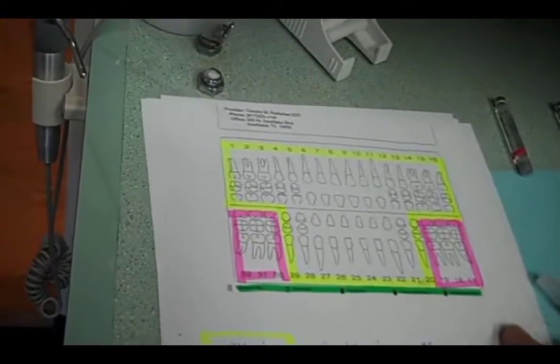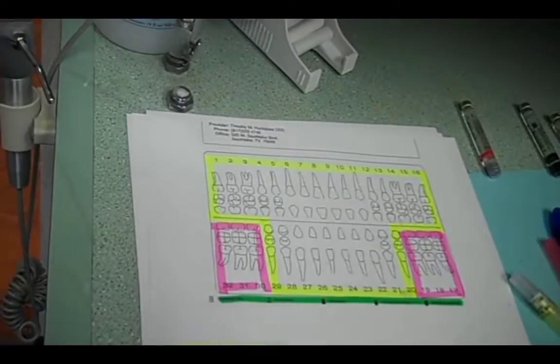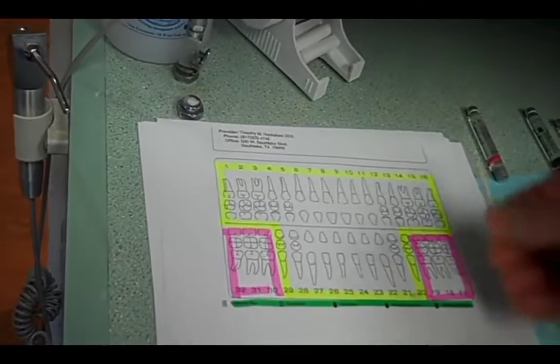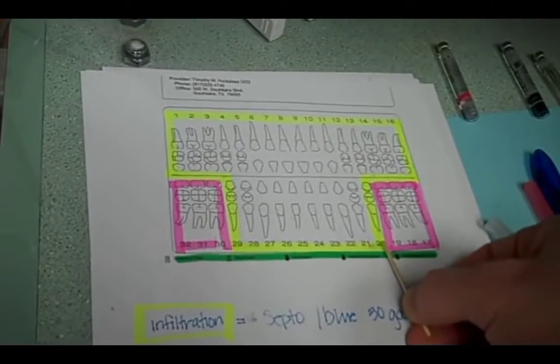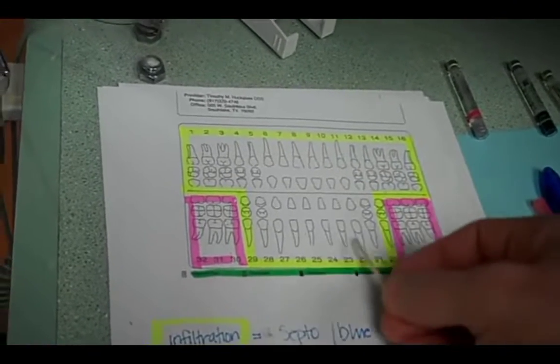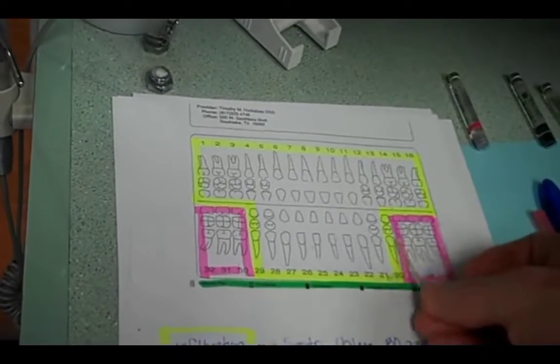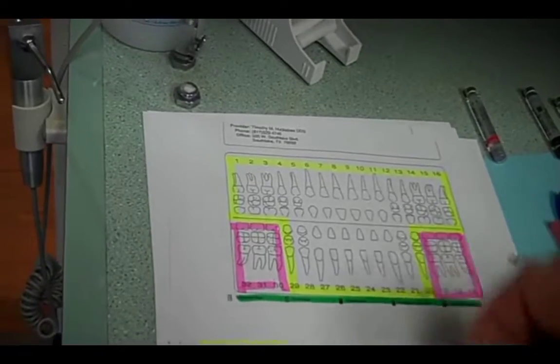So therefore, if we're going to inject on tooth number 6, we're going to give the anesthetic right here at tooth number 6. If we're going to inject on tooth 14, we'll give the anesthetic septicaine right here. If we're going to do tooth number 22, we give the anesthetic at tooth 20. If we're going to do tooth number 23, we give the anesthetic at tooth 20. If we're going to do tooth 20, we give the anesthetic at tooth 20. If that makes sense, anything forward.